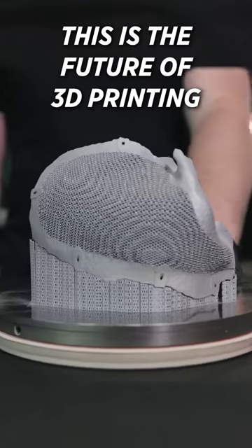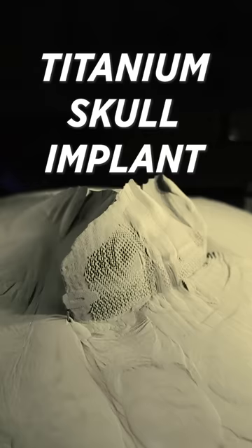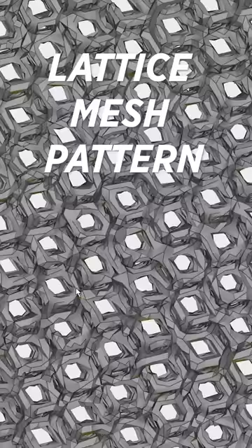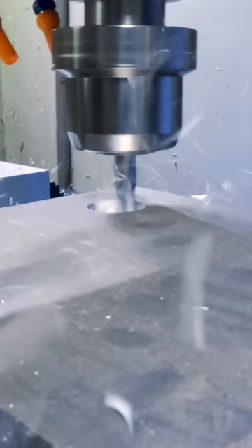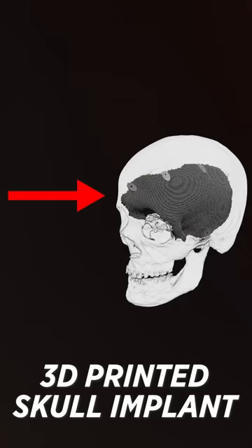And this is the future of 3D printing right here. The beautiful thing about additives is you can incorporate lattice structures into the surface of your implant. Whereas when they used to be CNC machined, you'd have to settle for a series of holes that are drilled throughout your implant.